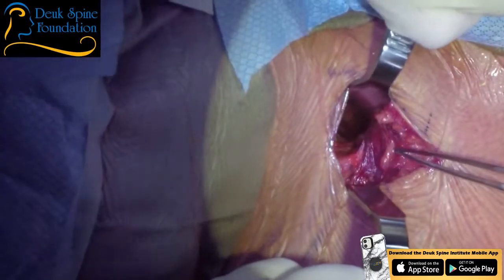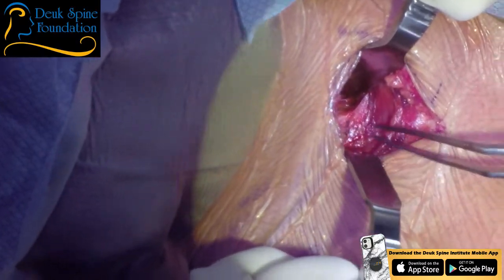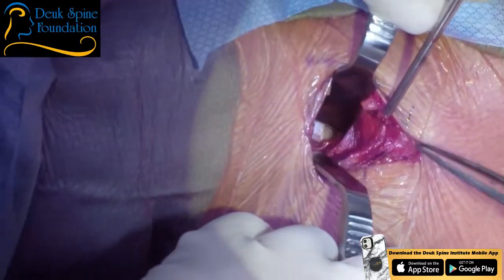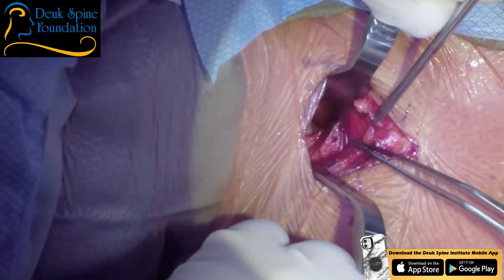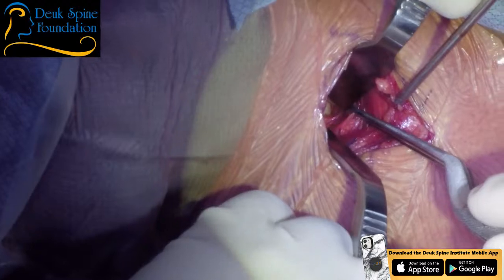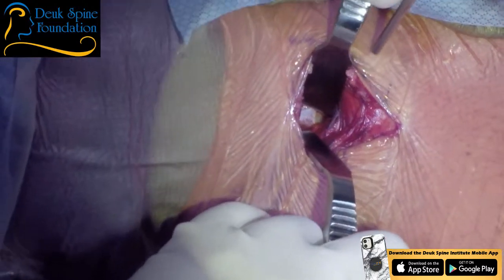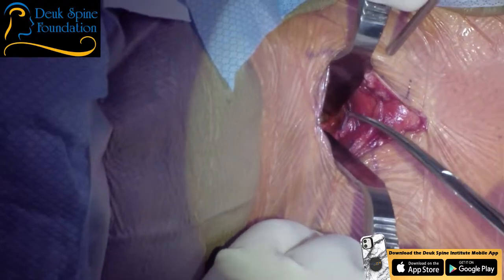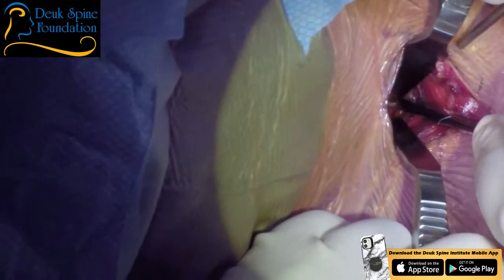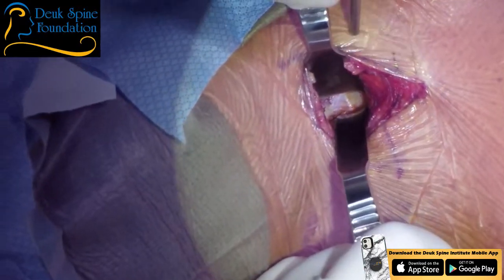We wanna verify that, but I wanna loosen all this up nice so we don't have to retract so hard, because retraction is something we wanna try to have as little force on as possible. Definitely the right choice to do an oblique incision. Scissor? That's really allowed us to free things up so we don't have to retract so hard. And the muscle relaxation is definitely helping. Okay, Kitty?